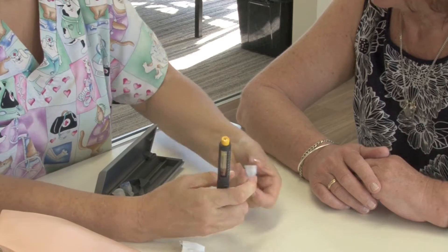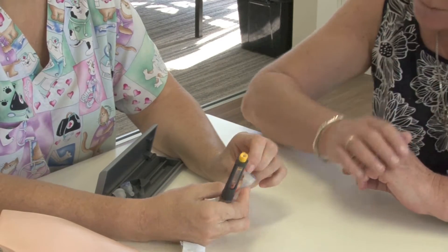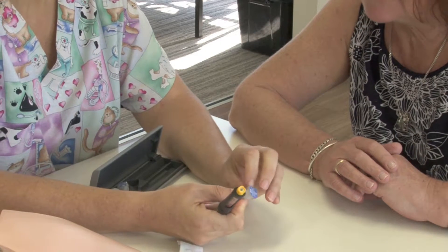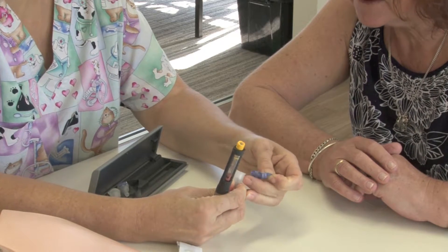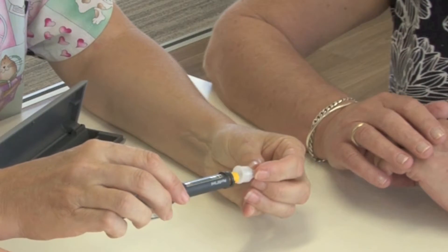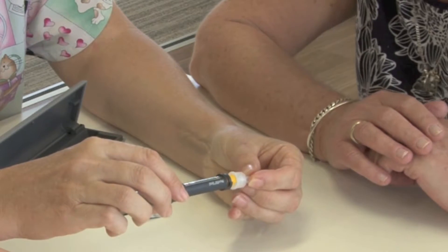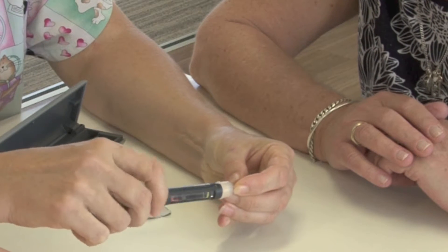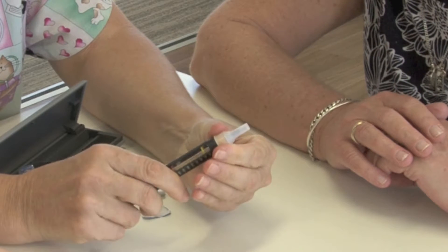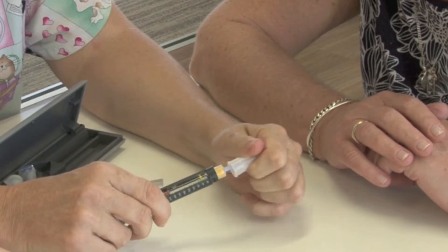So you then get one of your needles — just check the expiry date on it. Take the cap off. Now just be aware it's really quite sharp in there. I bet you might let the grandchildren play with that. Absolutely not — please don't let your grandchildren near it. Pop that in there and spin it on. So that now gives us our needle on the end.